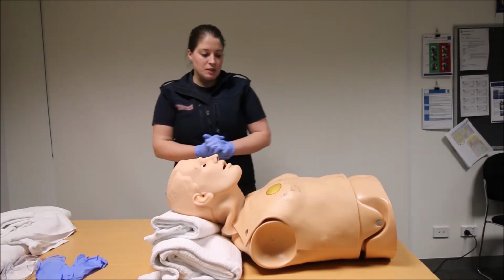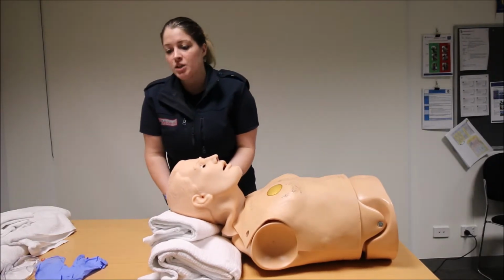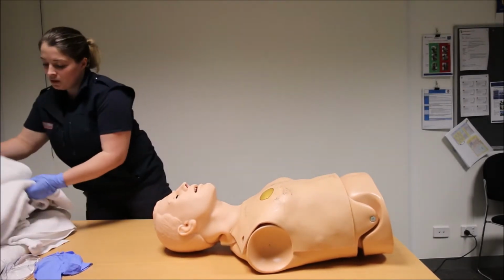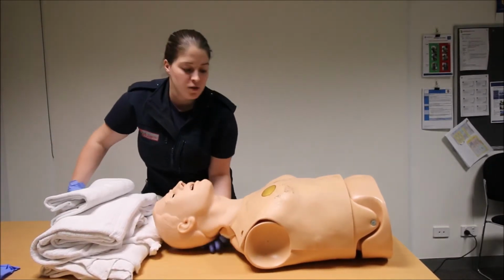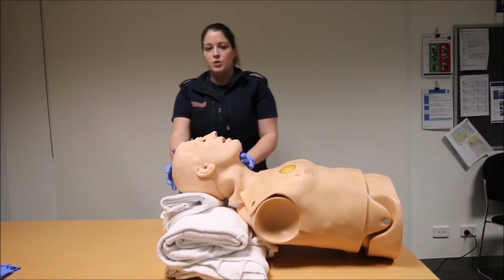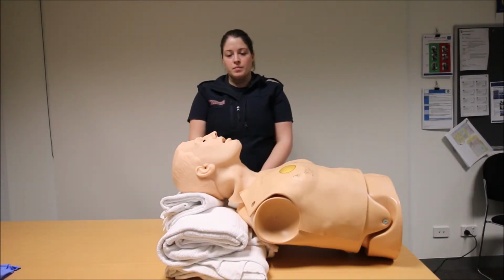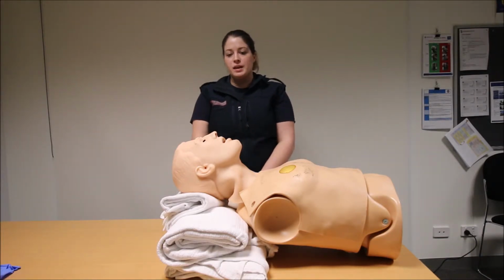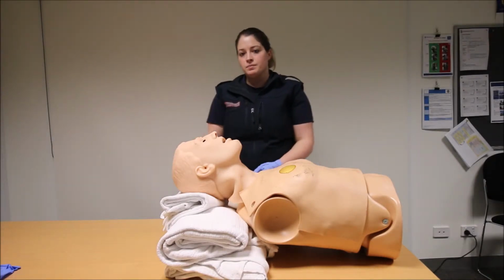Now, if the sniffing position has been unable to be achieved, or we have large obese patients or patients with reduced neck mobility, we can opt for the ramping position. The ramping position is achieved by placing padding under the shoulders and the head. Again, we are aiming to have our external auditory meatus at the level of the sternum. Research suggests there is no improved benefit with either of the positions, so it is best to learn one, learn it well, and apply it to all patients.